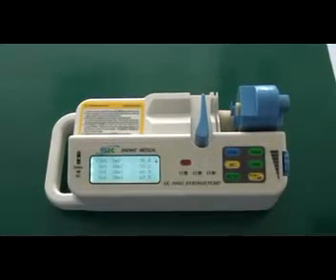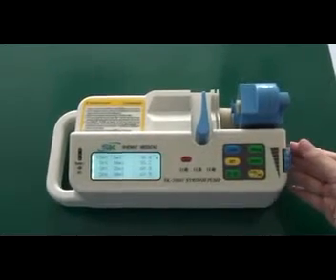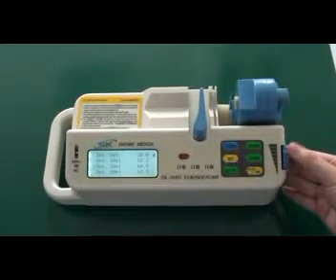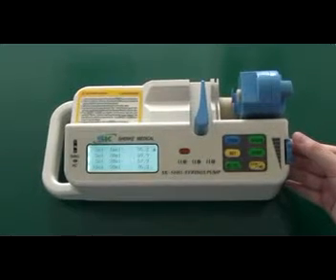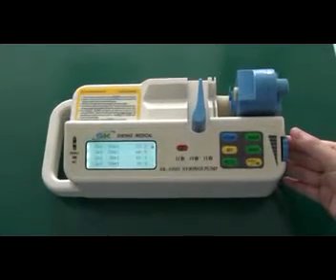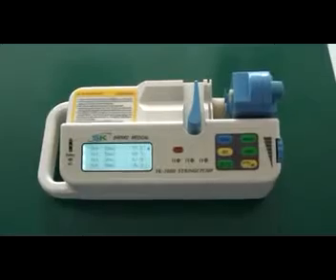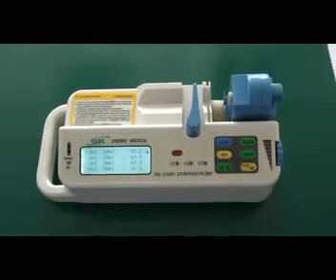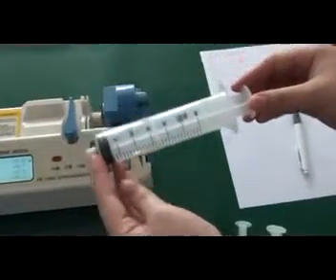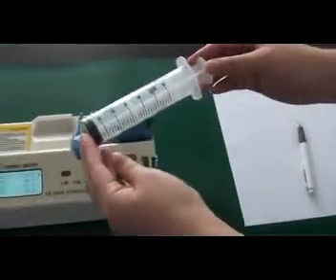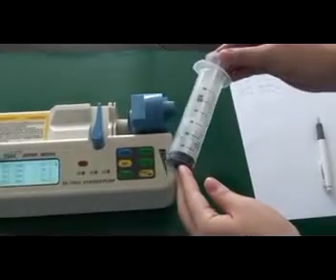Thirdly, turn the adjusting knob to make the cursor point at set 50 ml. Then fix the 50 ml syringe into the pump. How to fix this? You need several steps to follow.